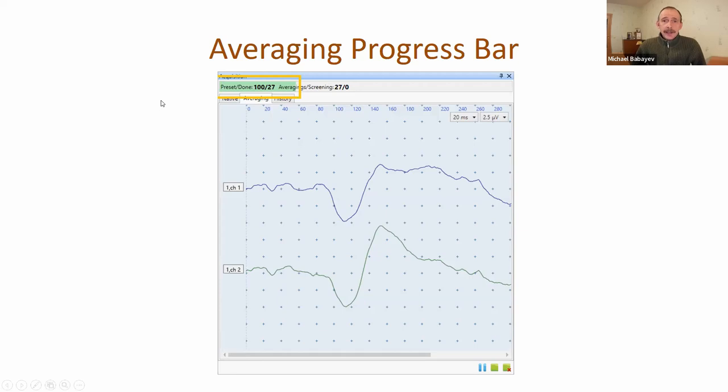We added an averaging progress bar in the acquisition window. Previously, if you were far from the screen near the patient, you had to look for very small numbers showing preset and done. Now we added a green bar that can be visible from a very long distance, so you can watch this bar and understand what stage the averaging process is at.